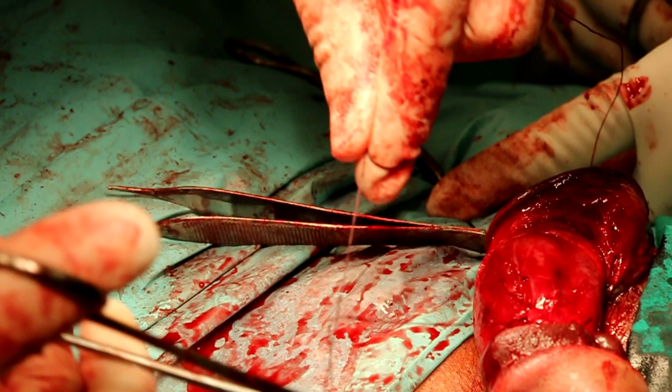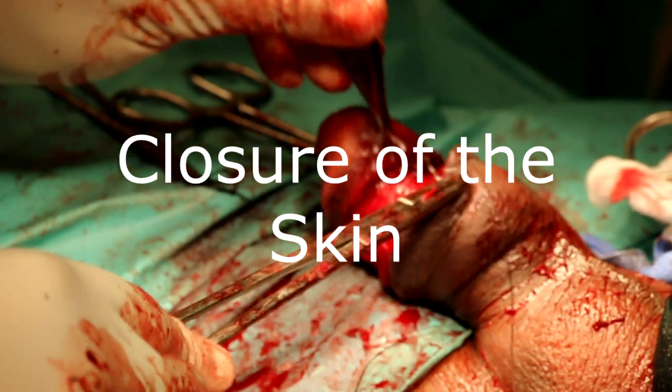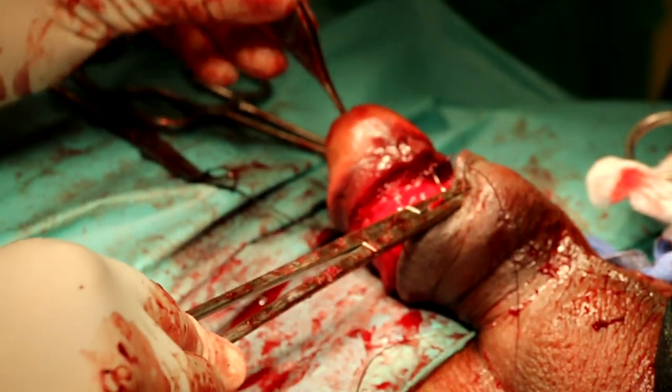Here's a good picture. As you see now, the penis is completely covered. The fascia has been completely approximated. Closure of the skin should be the last step.